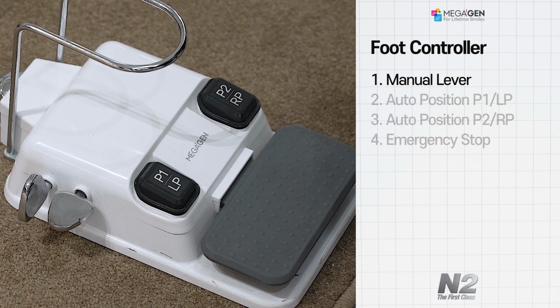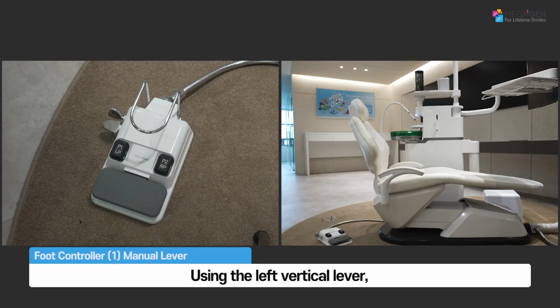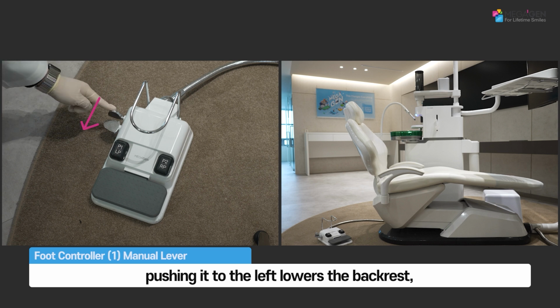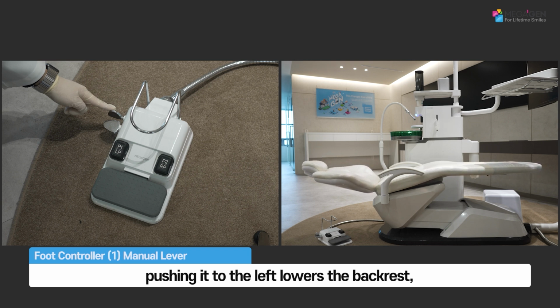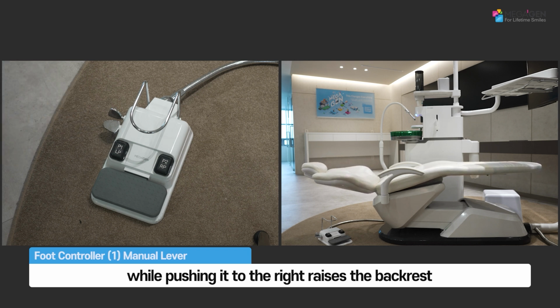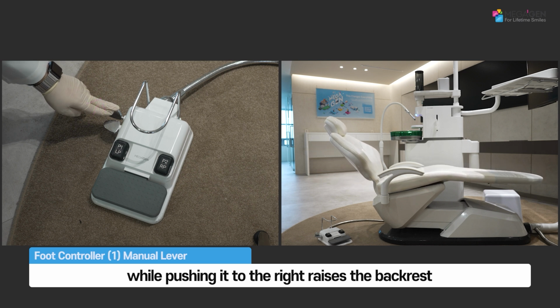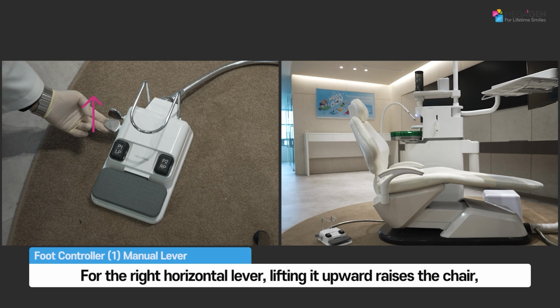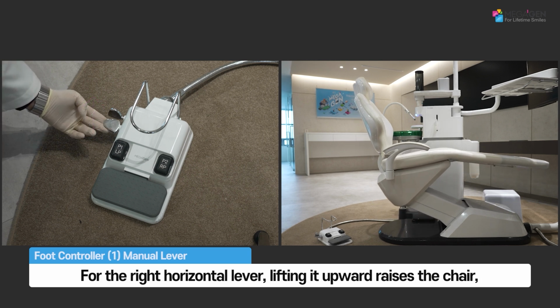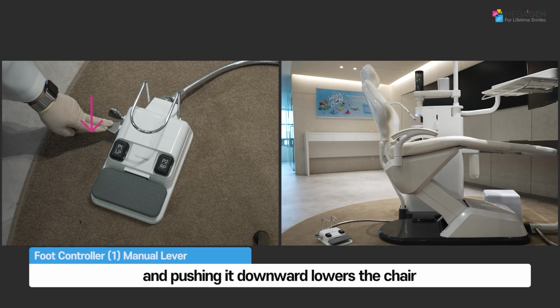How to use the foot pedal. The foot pedal is used to manually adjust the chair's position. Using the left vertical lever, pushing it to the left lowers the backrest, while pushing it to the right raises the backrest. For the right horizontal lever, lifting it upward raises the chair, and pushing it downward lowers the chair.